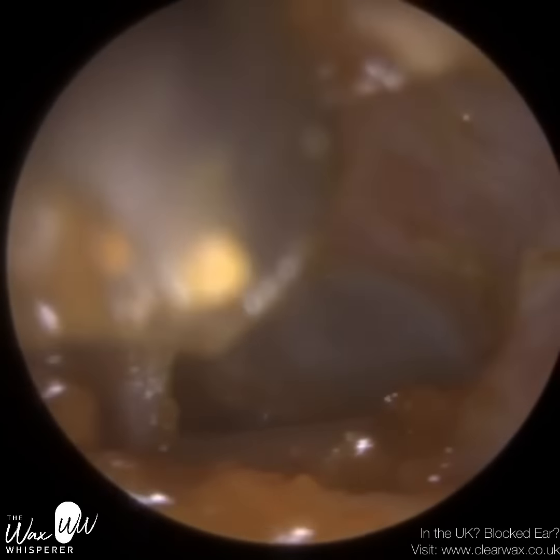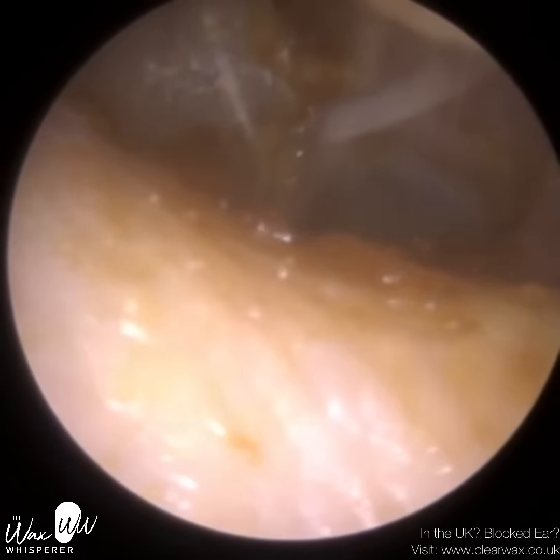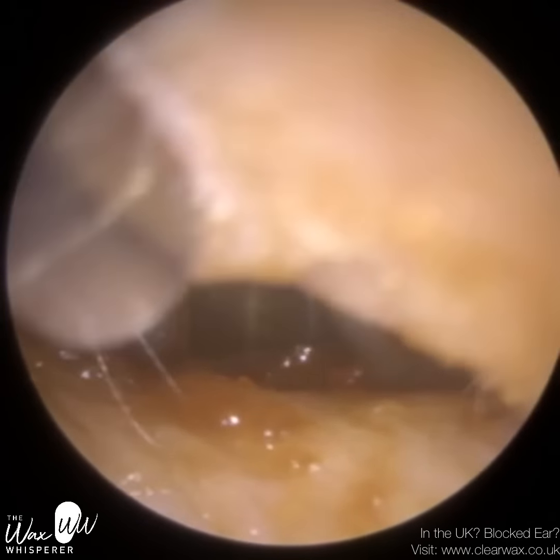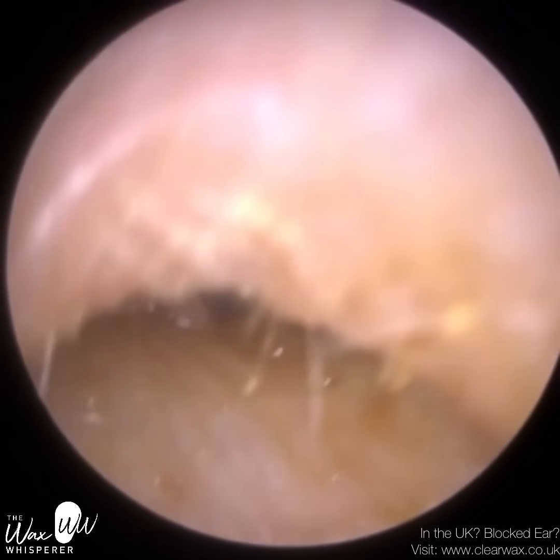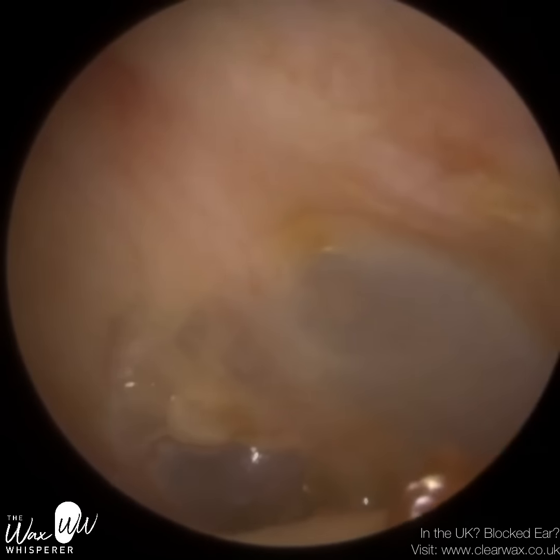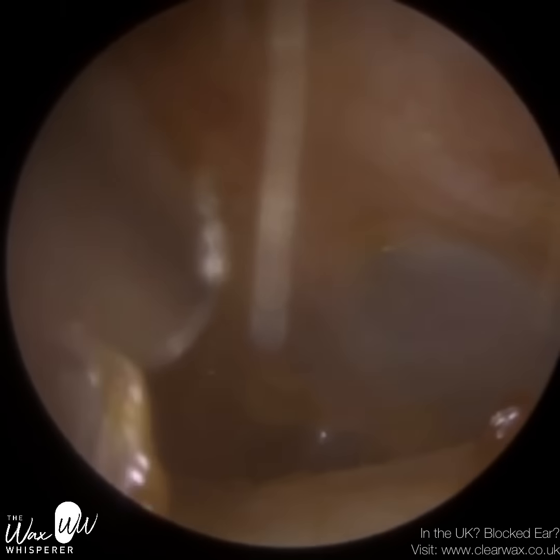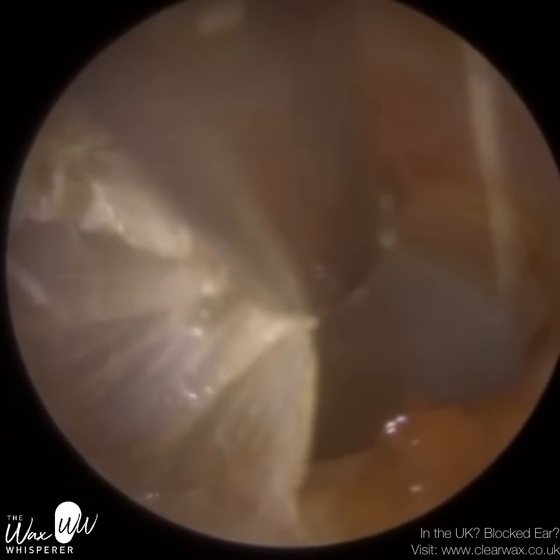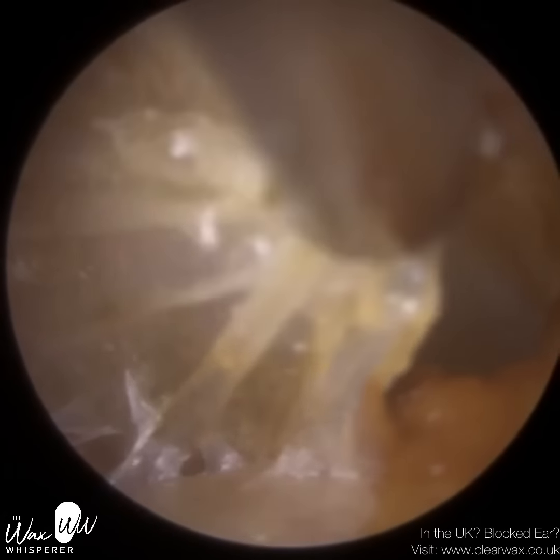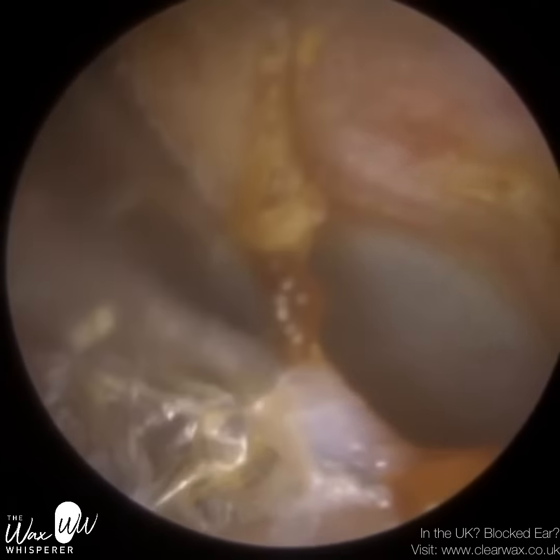We're going to peel some skin away. You can see, I'm having to widen the ear canal entrance with the instrument, the suction probes. It's so narrow. It's a bit of dead skin. We're not trying to get every little last speck out. You can see I'm just going to go in. I'm going to stretch open the ear. I'm using the endoscope now, almost like a doorstep, to keep this cartilage open, which then allows me to insert the suction probe. This is residual skin. Just peeling this from the roof of the ear canal and from the front part of the ear canal. I think there's a flake of skin left over at the end. We're not too worried about that.